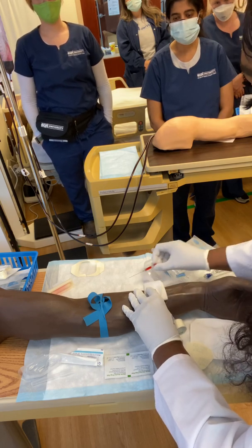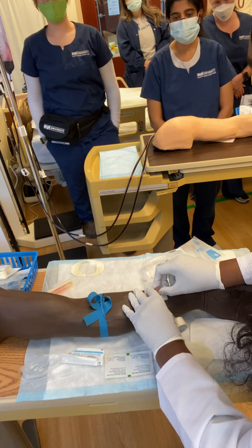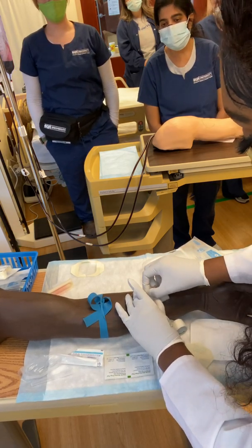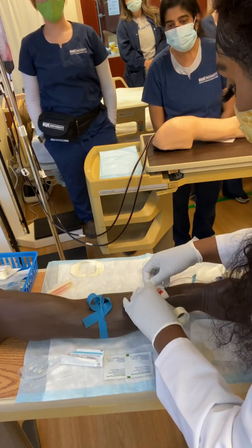There's some kind of retraction. I haven't learned that one yet. And then we're just going to tie that. And then we just insert it. And it'll look like this one is going crazy, but it'll be okay. So then we just insert it.